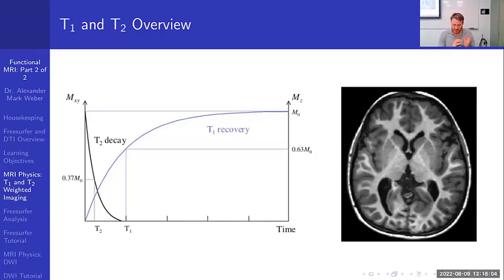This energy must be transferred somewhere, and that somewhere is into nearby nuclei, atoms, and molecules, and this is all done through collisions, rotations, and electromagnetic interactions. At the most basic level, T1 relaxation is simply an energy flow between spins and their external environment, whereas T2 was spins and spins. In order to induce the transitions needed for T1 relaxation, the fluctuations have to be at the Larmor frequency.